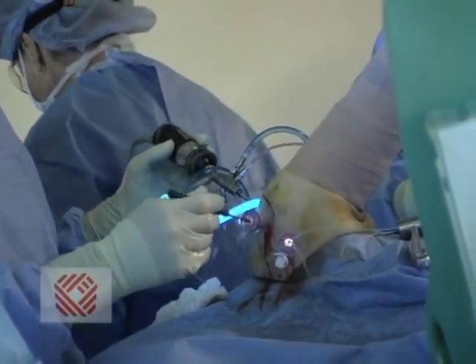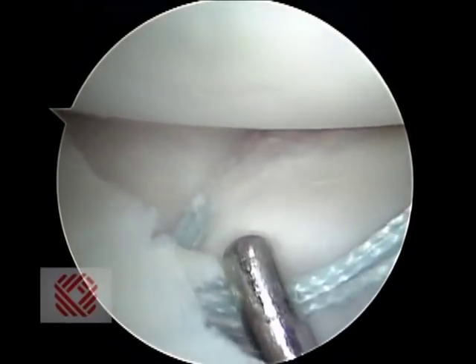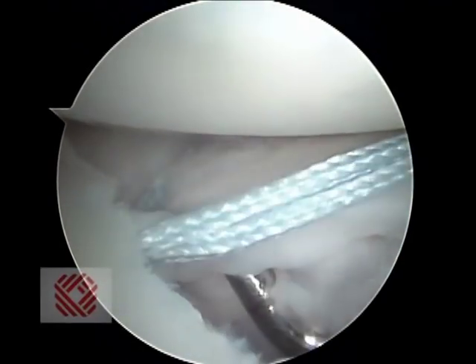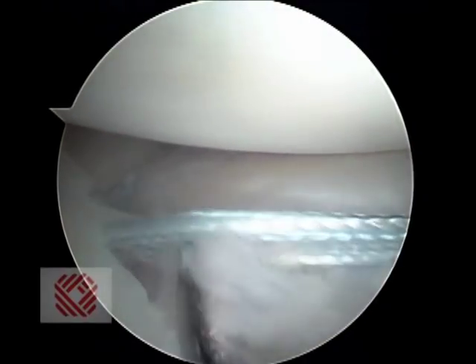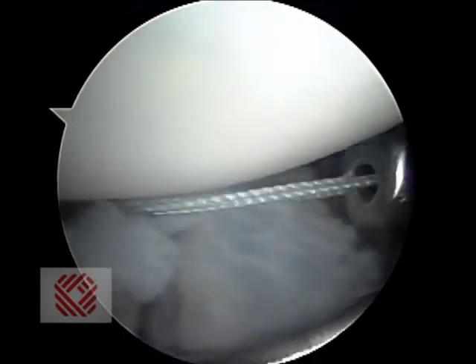We're doing this through three little holes, and it's really a nice repair. You want to see that tension of that ligament — that's really good. Now we're going to cut these sutures, protecting the rest of the repair site, and cut them flush.